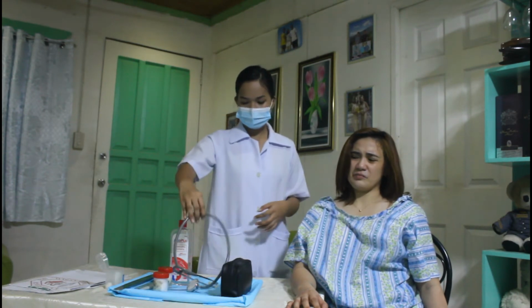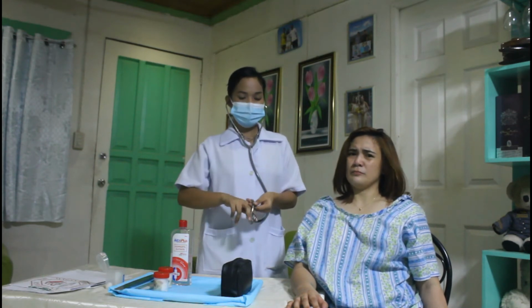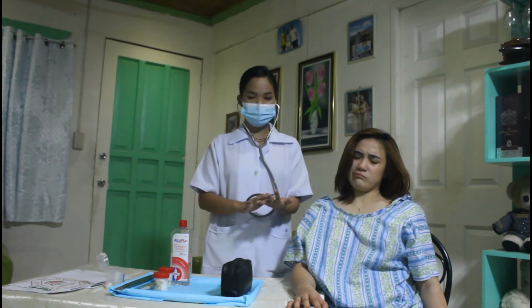Then, we use this equipment, the stethoscope. So, since nursing is an art, then we hold this like this. So, place the diaphragm of the stethoscope in our palm for at least 5 to 10 seconds. So, this will provide warmth to the metal of the diaphragm and to prevent the patient from being startled.